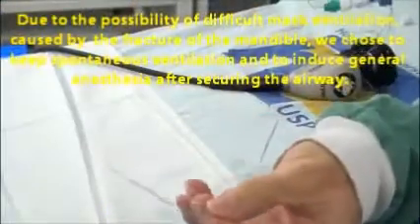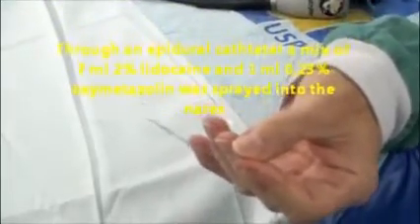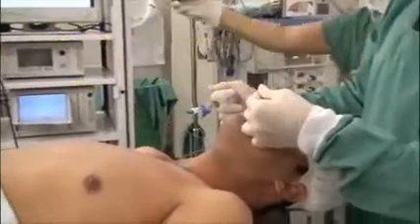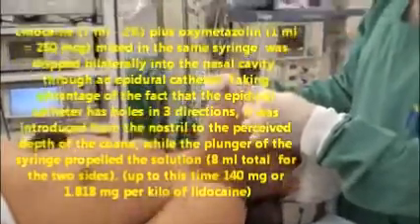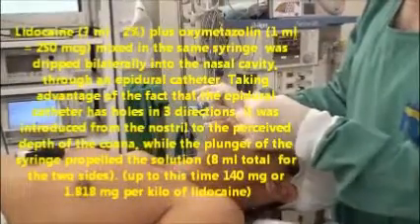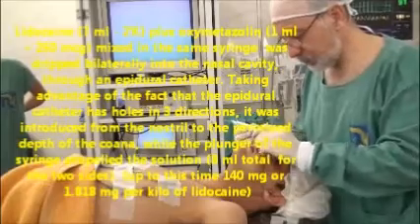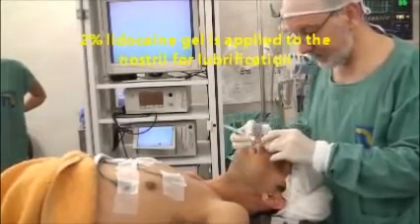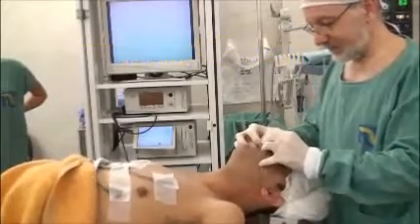Taking advantage of the multi-hole tip of the epidural catheter, we used it to spray a mix of lidocaine and oxymetazoline inside the nostrils with minimal discomfort to the patient. After applying 2% lidocaine in each nostril, we applied 10% lidocaine. We asked the patient to hold his breath while applying 2 puffs in each nostril.